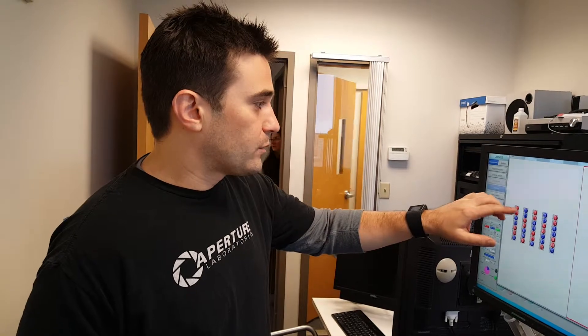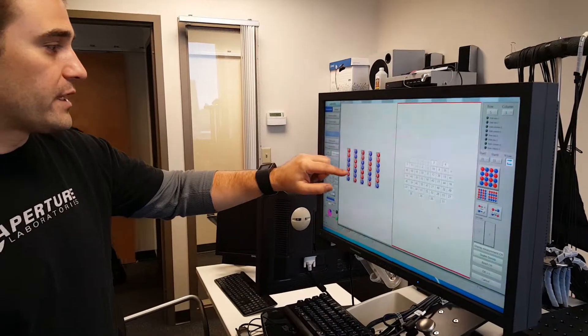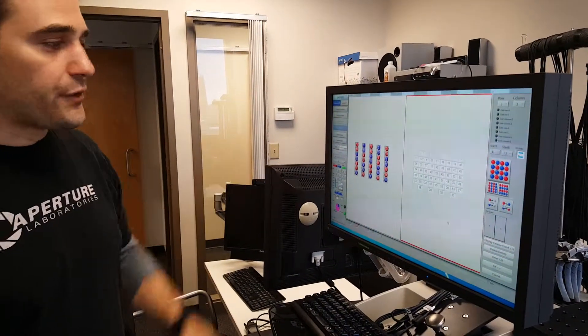It's just a limitation of how many optos you have, and you can have 40 emitters and 40 detectors that you can play with. So this one only requires a total of how many, 1 2 3 4 5 by 1 2 3 4 5 6 7, 35.